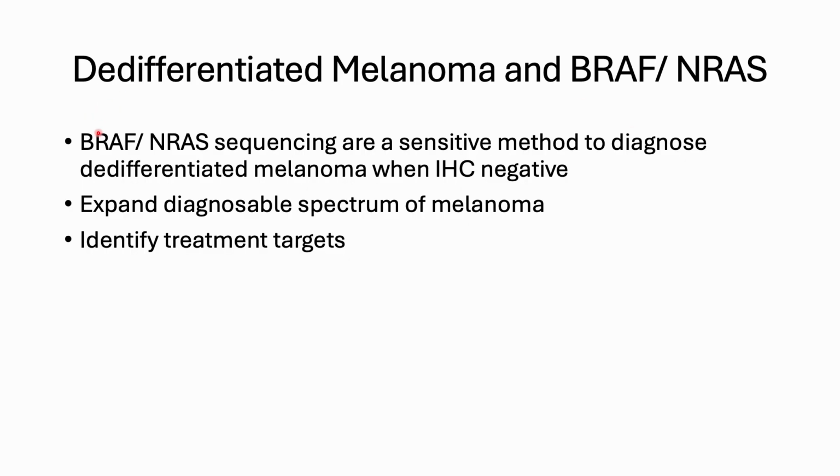So in summary, BRAF and NRAS sequencing are a sensitive method to diagnose dedifferentiated melanoma when the immunohistochemistry is negative. They can expand the diagnosable spectrum of melanoma and also identify potential treatment targets.